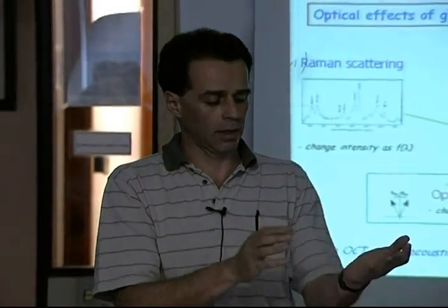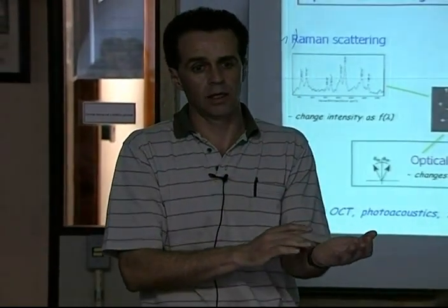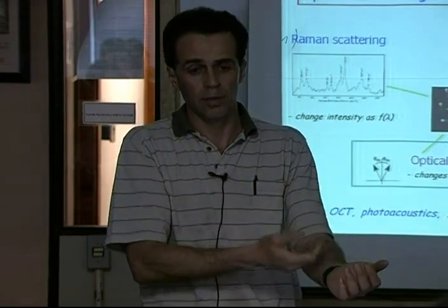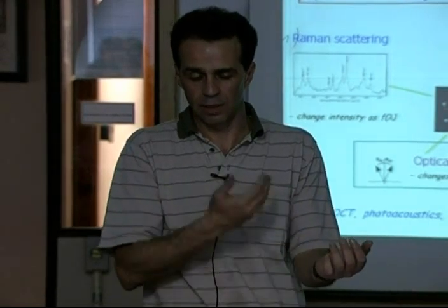But that's actually a very interesting question. How does the tear glucose reflect what's happening in the body? So there's a time delay and a signal change, which this group in Maryland is trying to quantify. So it's possible. There's also been tattoos, so you can do a tattoo that changes color. There's been different patches based on some of the things you and I discussed yesterday about interstitial fluid that's being sucked like a tobacco patch, but it's going the other way. So it's not blood glucose and it's not real time, but it's some continuous monitoring.